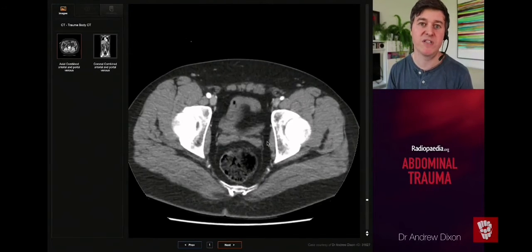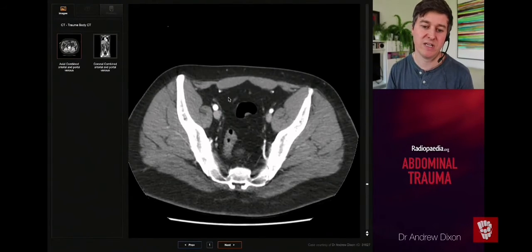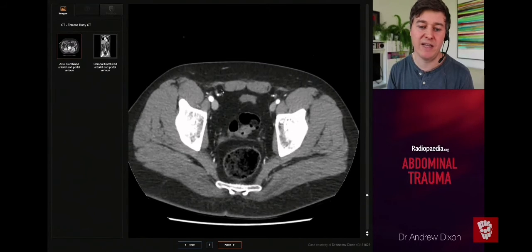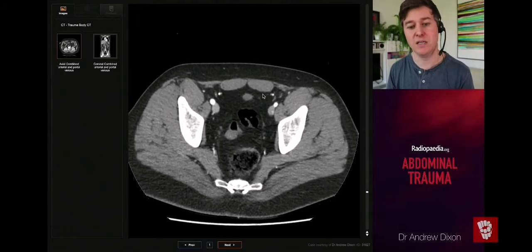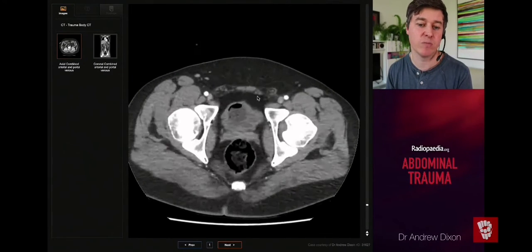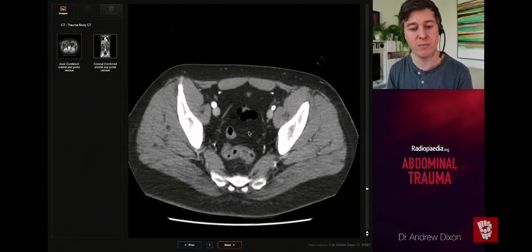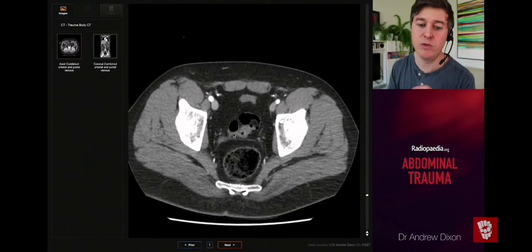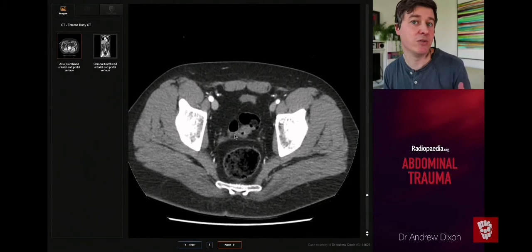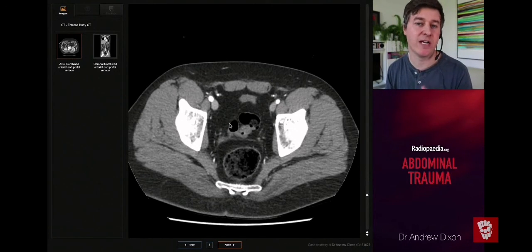If you see fluid in this pelvic sidewall here, that is not in the peritoneal compartment. That is in the extraperitoneal pelvis. If you see fluid anterior to the bladder underneath these rectus muscles here, that is not in the intraperitoneal compartment. That is in the retropubic space, which is part of the extraperitoneal pelvis. So really important, you should be checking here anterior to the rectum, posterior to the bladder, above the seminal vesicles for free fluid, peritoneal fluid, and it should be really well defined because it's in a potential space. So it should have really well defined margins to it, unlike extraperitoneal fluid, which we'll see later, is very ill-defined because it's infiltrating through fat.